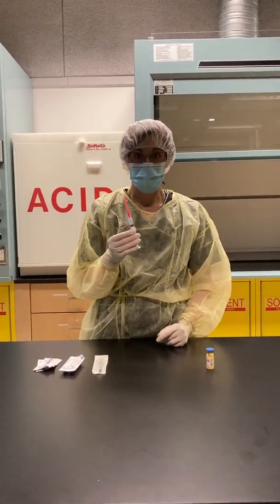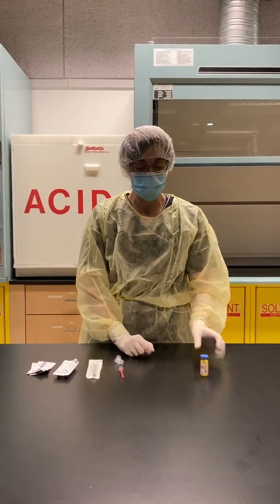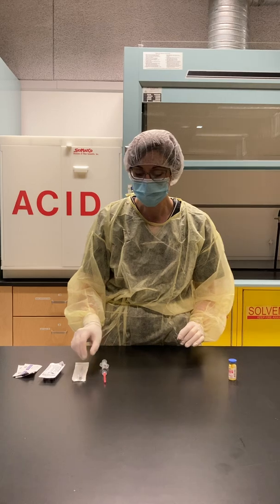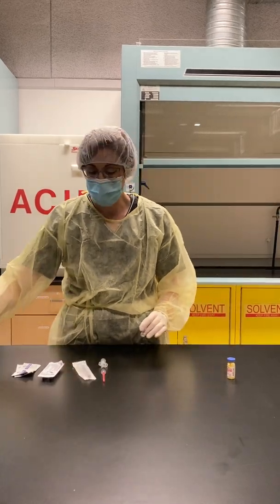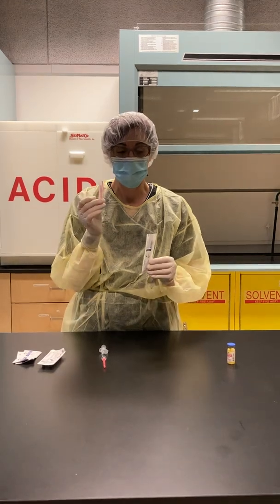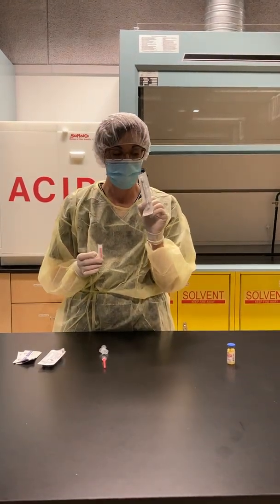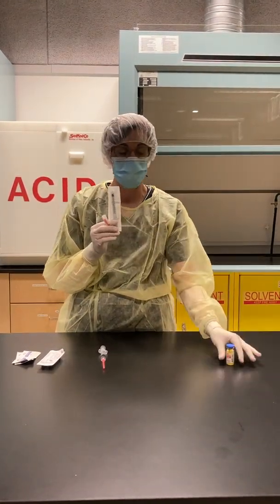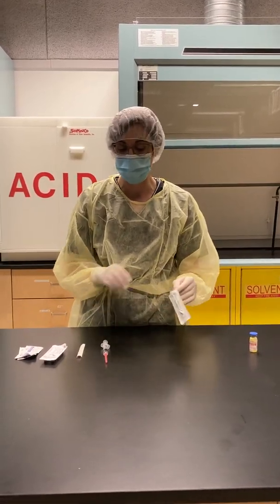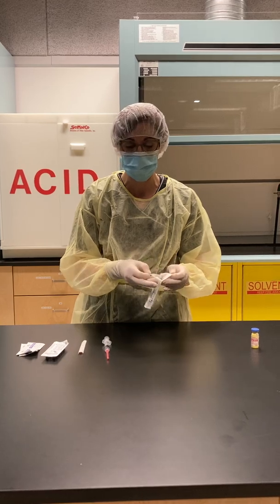I've drawn up my two mils of sodium chloride. Now we're going to practice reconstituting a bottle. I'm going to put a needle on the syringe that I will be drawing up the drug with once it's reconstituted. The reason for this is to avoid any possibility of particulate contamination.